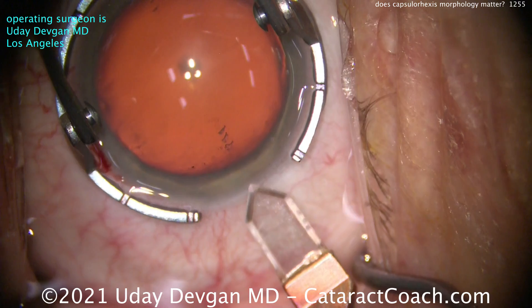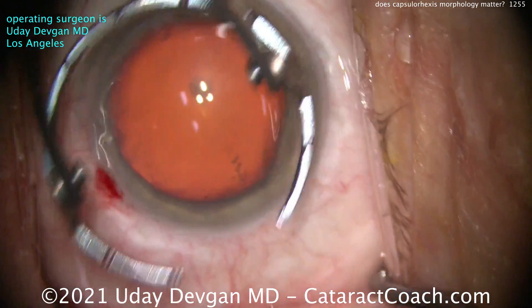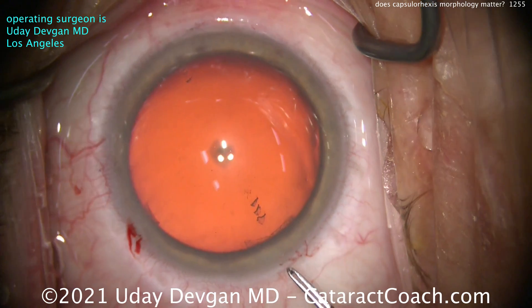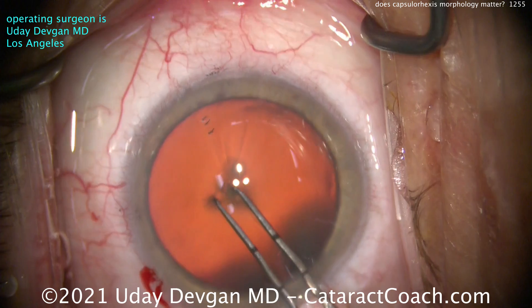Here we're making the incision on that steep axis, and we've taken this into account for our toric IOL calculations. That looks like a nice incision. Now here's where we do the rhexis. Normally I do a rhexis counter-clockwise, although it really doesn't matter which direction you go. I'm measuring there, getting an idea, and starting to make the rhexis.